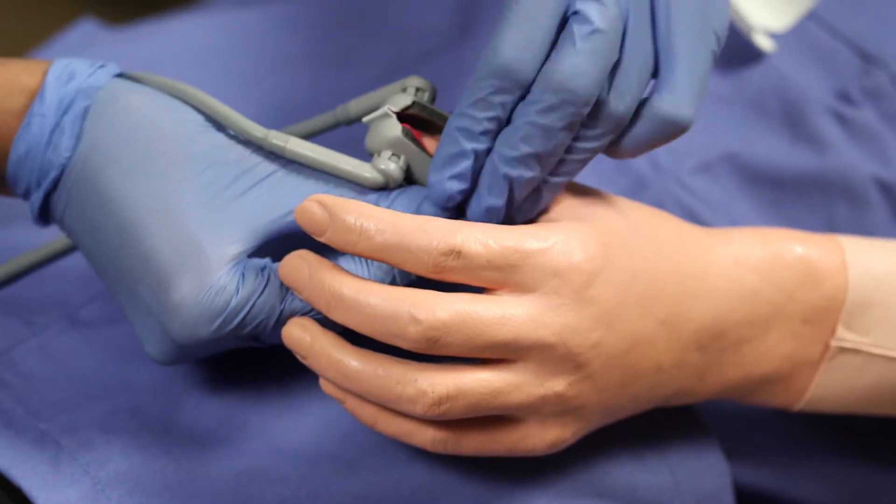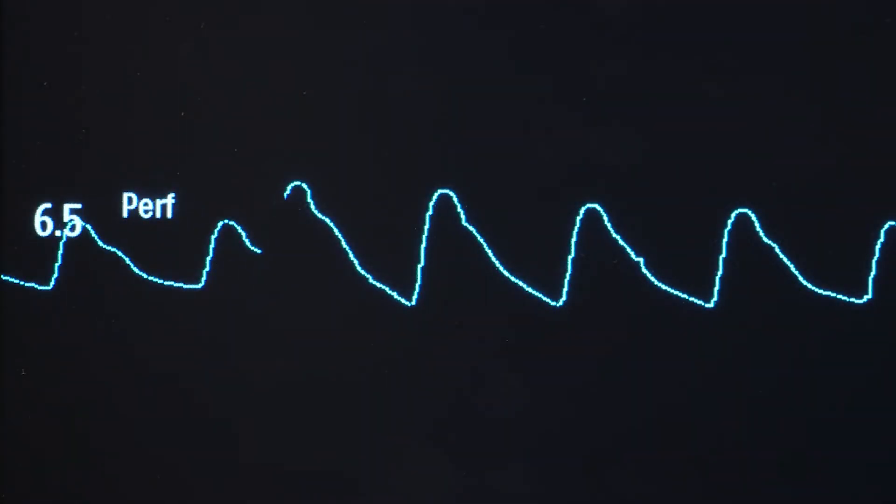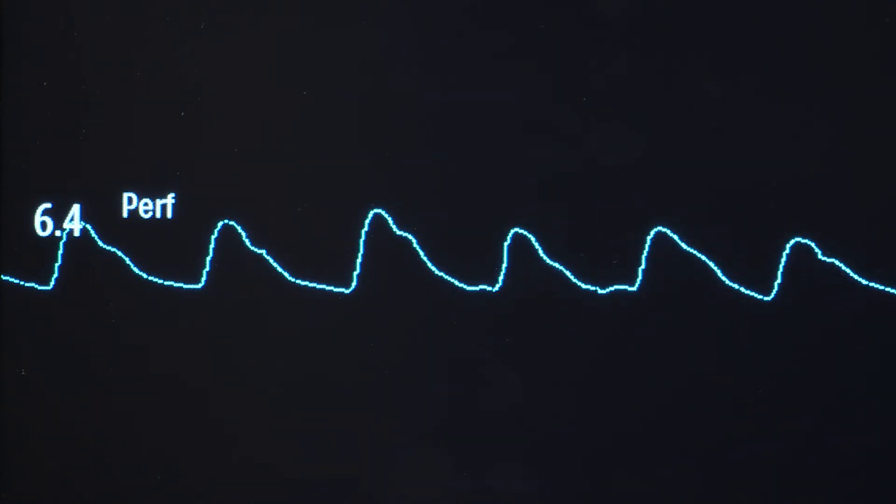After you place the clip on the patient, be sure to look at the perfusion index number. If that number is higher than 0.3, that means you have a good connection. If it is not, you can try a different finger.